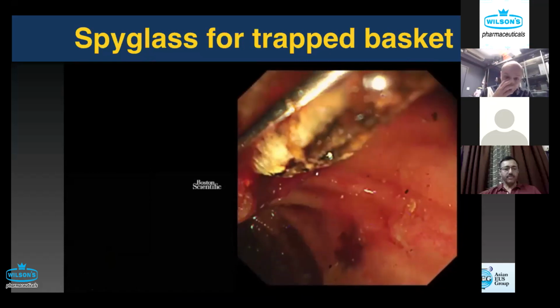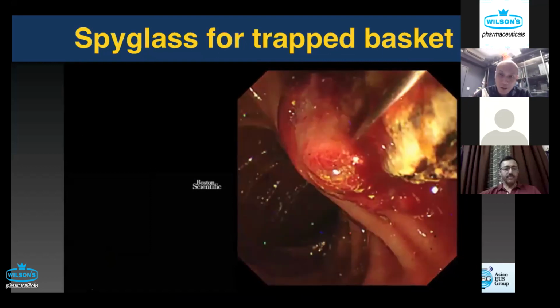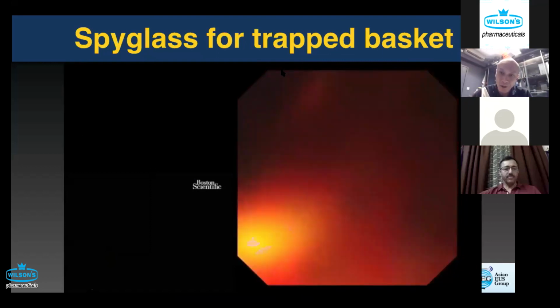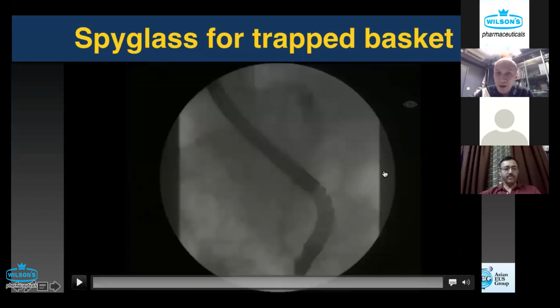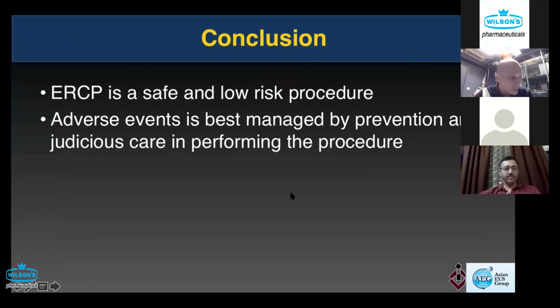So I think nowadays a trapped basket is mostly dealt with by endoscopic methods. Of course, there are other described methods, like using another balloon to catch the trapped stones. All these can be tried. I'm going to conclude this lecture by saying that ERCP is a safe and low-risk procedure. Adverse events are best managed by prevention and judicious care in performing the procedure. Thank you for your attention.